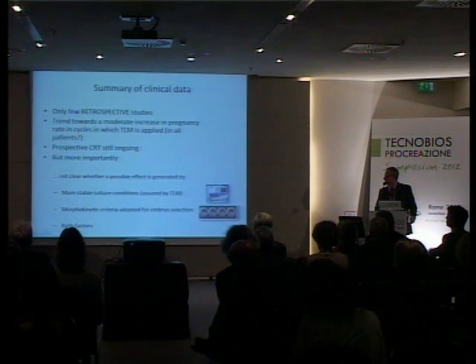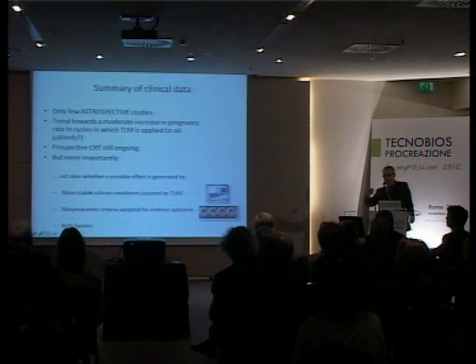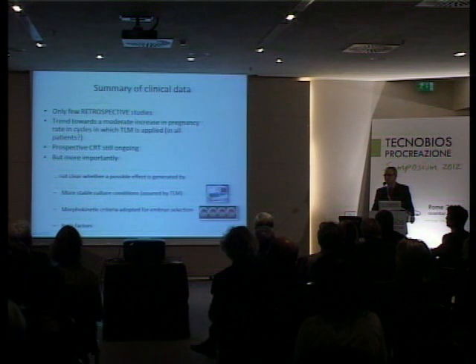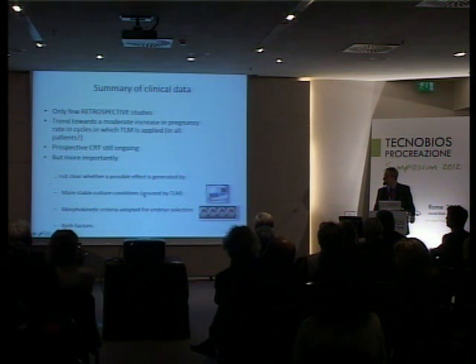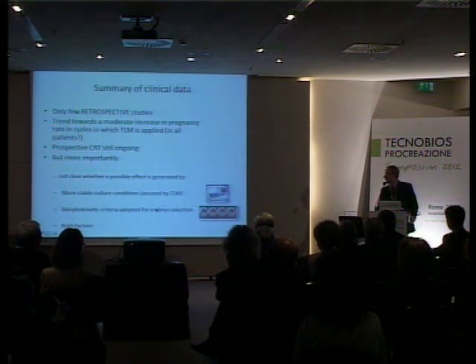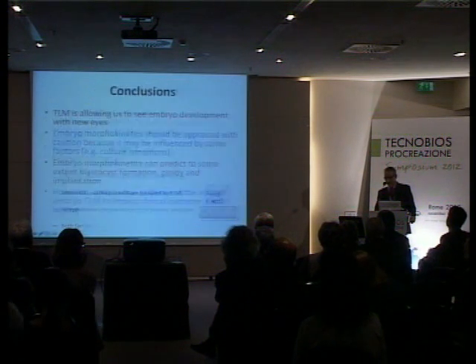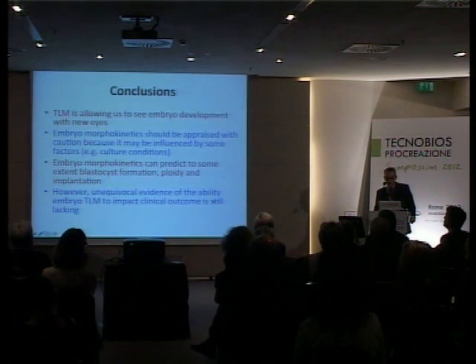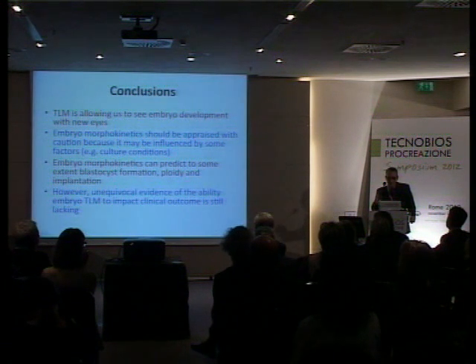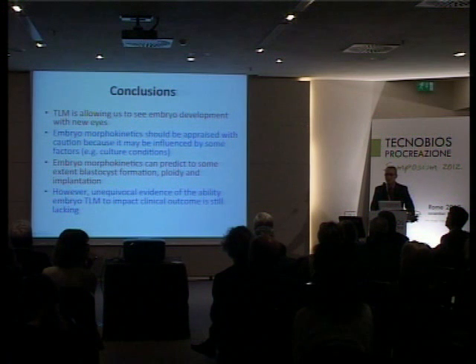But all these studies have the bias that they are not able to discriminate whether a possible positive effect of time-lapse microscopy is due to better morphokinetic criteria for embryo selection, or in fact better incubation conditions, which are assured by this kind of instrument. So the conclusions are that, of course, time-lapse microscopy is allowing us to see embryo development with brand new eyes.